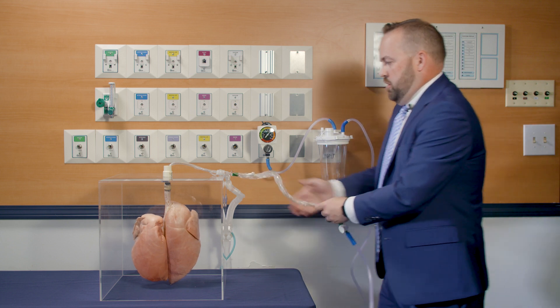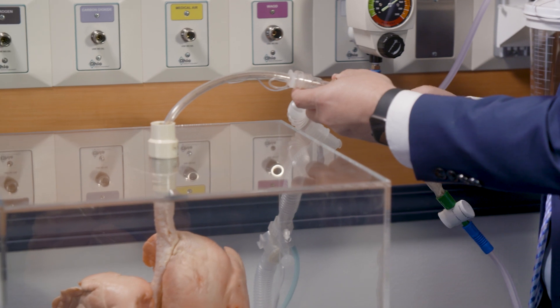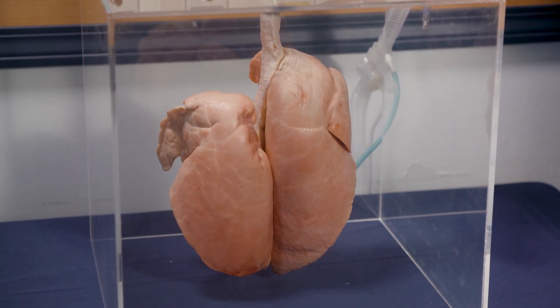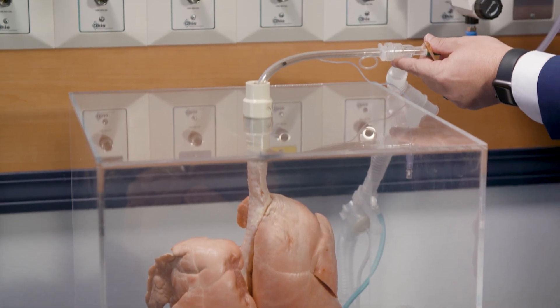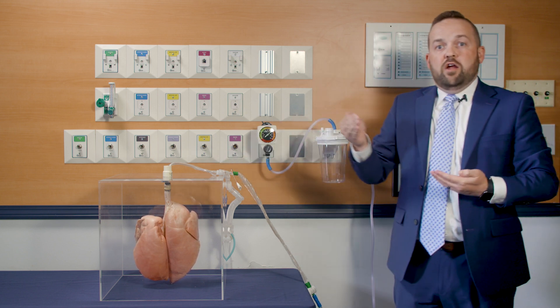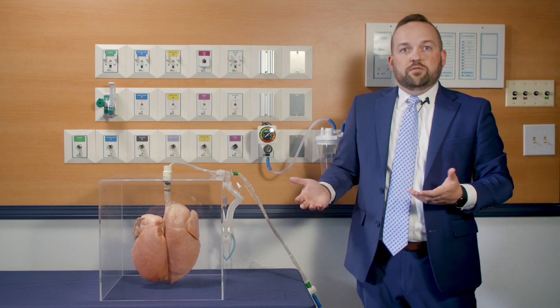I'm going to apply suction and insert the catheter into the lung. You can see now the ventilator has more time to put more air into the lung as we're doing the procedure, rather than removing all of the air and causing atelectasis — much more effective at preventing those hazards. You must remove the suction tubing from the catheter and occlude the end with your hand. While occluding the tubing, the regulator is adjusted to the appropriate pressure for the specific patient population. If you do not occlude the tubing, it leaves it open to the atmosphere and the regulator will measure pressure relative to the atmosphere — much lower than when the system is occluded. To set an accurate pressure limit, you must occlude to set.